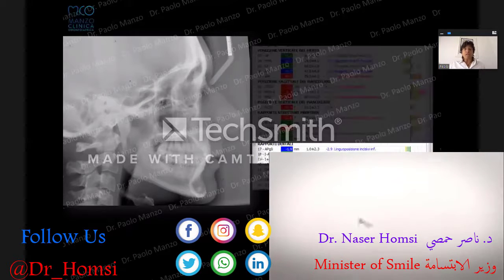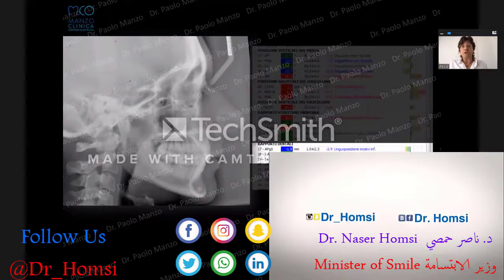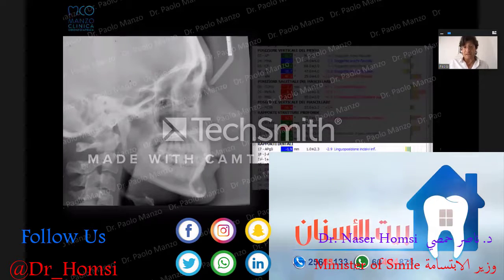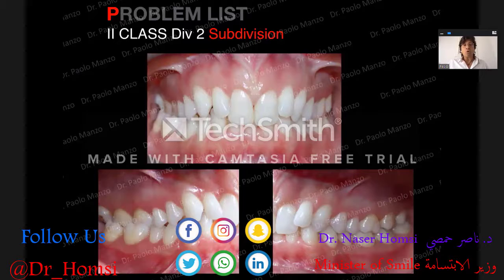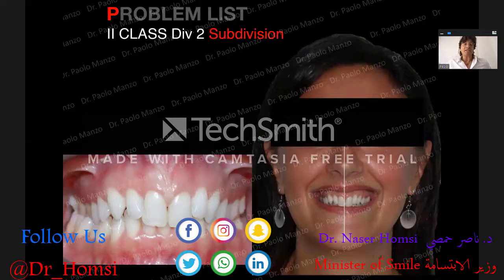This is also confirmed by the X-rays and by cephalometrics, because we have lingual inclination of the lower incisor and lingual inclination of the upper incisor. Okay? We have to correct this. Then we have another problem, which is the class two subdivision. This means we have class two on the right, and we have to correct this. This is connected with a small amount of dental upper midline deviation on the left, and this is important not only for diagnosis, but also for the planning of the treatment.